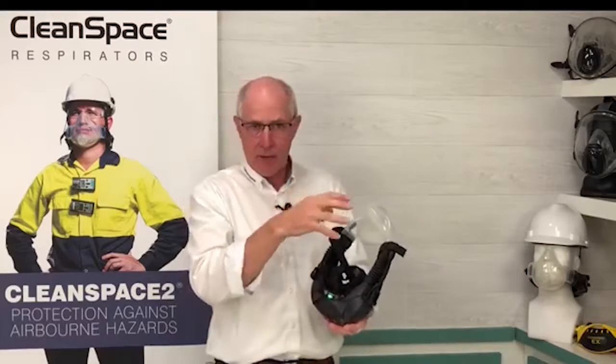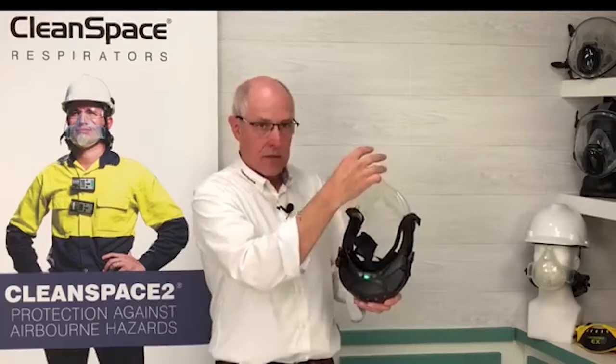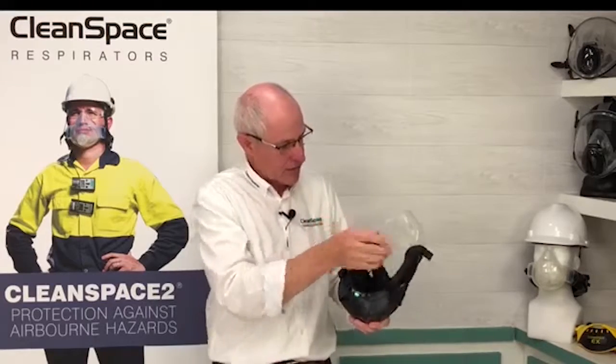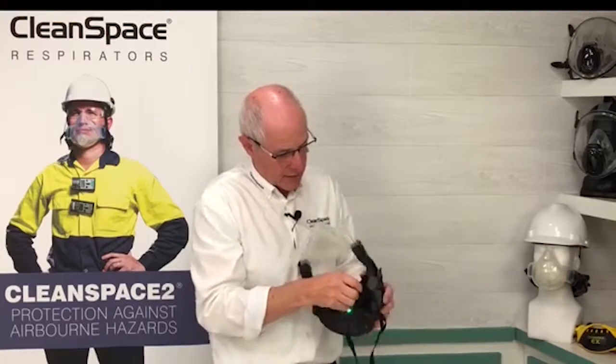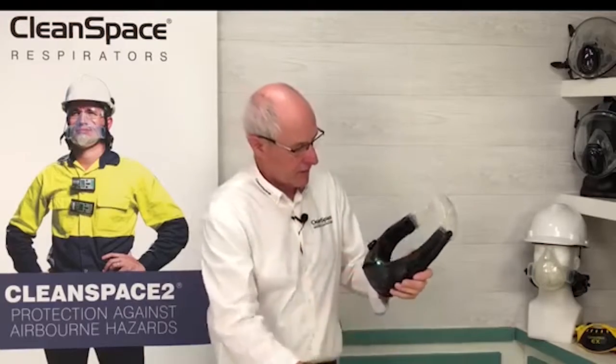I'd like to talk a little bit about the fit components that come with CleanSpace. As I've mentioned, we have a neck pad, we have a harness, and we have a mask. Okay, so I'm just going to remove those components. I'd just like to talk a little bit about them and then show you how you actually fit them to the CleanSpace. So to start, I'm going to take the neck pad and the harness off, and I'd like to talk firstly about the mask.